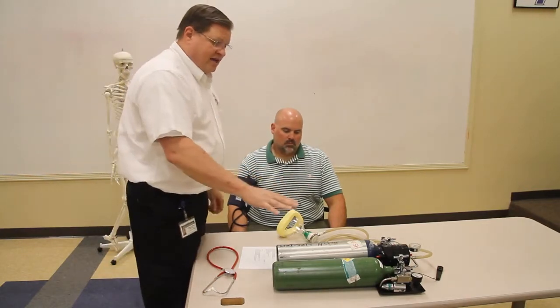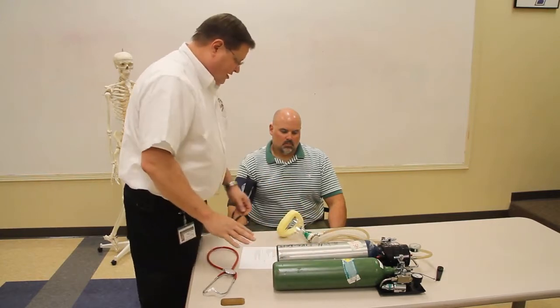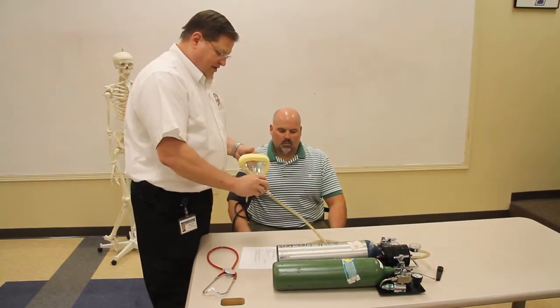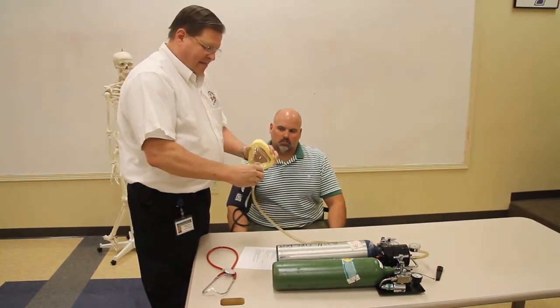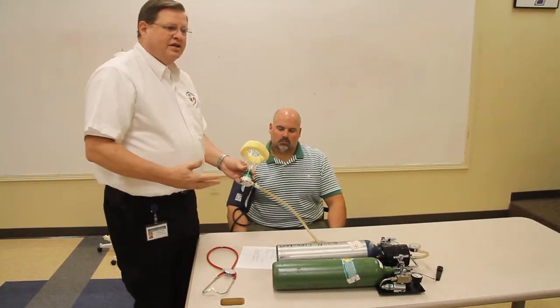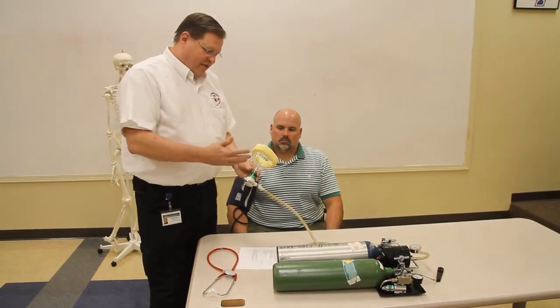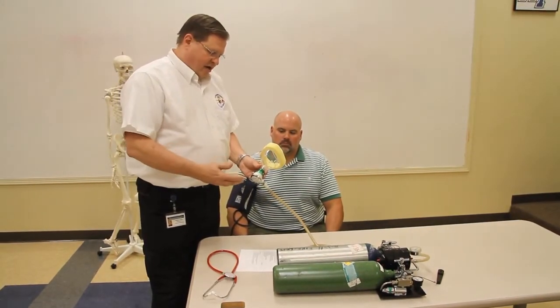Once those tanks are on, and once you have your gauges adjusted, we're going to put a clean mask on the nitrous oxide. The important thing to note here is our patient is alert enough to self-administer the nitrous oxide.